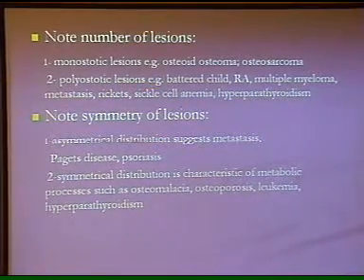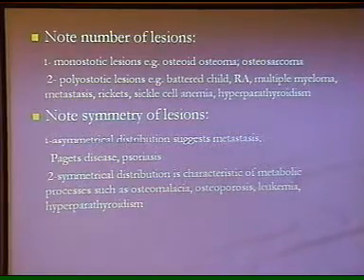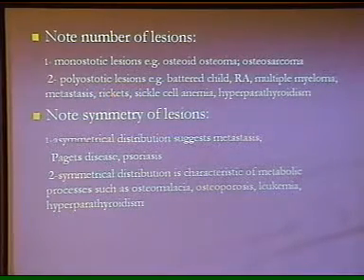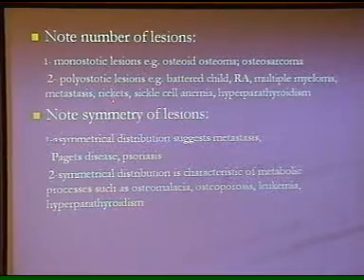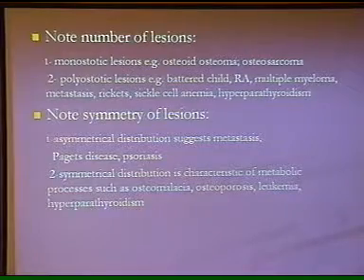One thing is very important: the history of the patient is very, very important, and I always say the best is to correlate with the opposite side. If you're suspecting pathology on one side of the limb and in the history of any disease entity, always take the opposite side and take the AP and the lateral view, and sometimes even the oblique views may be helpful to make the diagnosis complete.